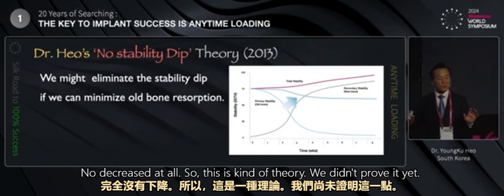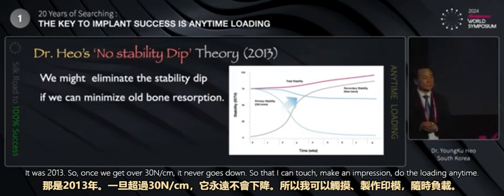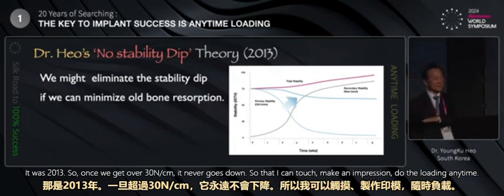So this is kind of theory. We didn't prove it yet. It was 2013. So once we get over 30 Newton centimeters, it never gets down, so that I can touch and make an impression, do the loading anytime.